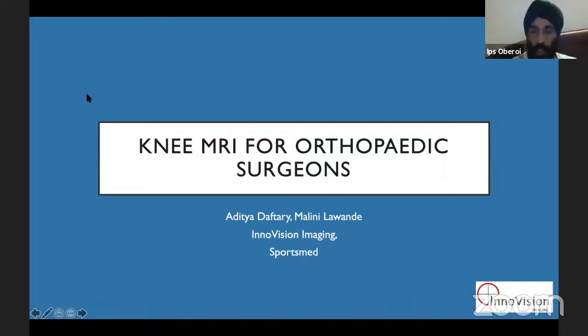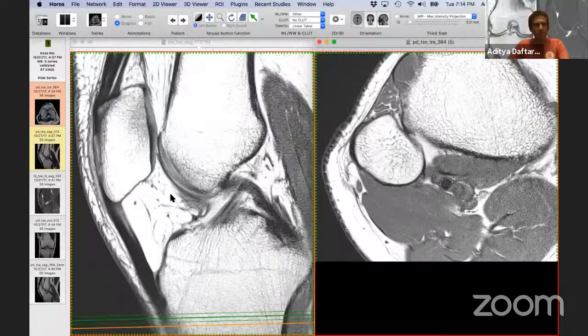Aditya, how do you manage to put all these three image sections on a single screen and then scroll in a way that all three start scrolling? So this is, do that?